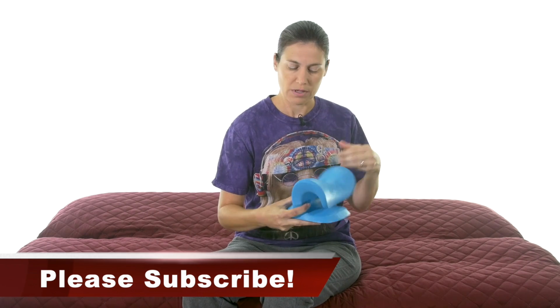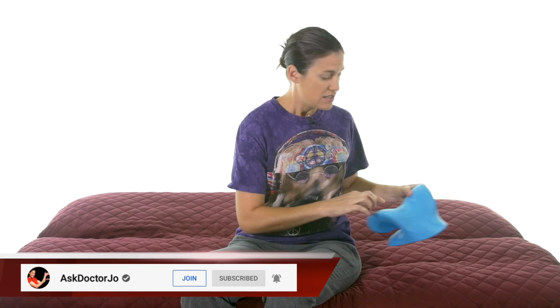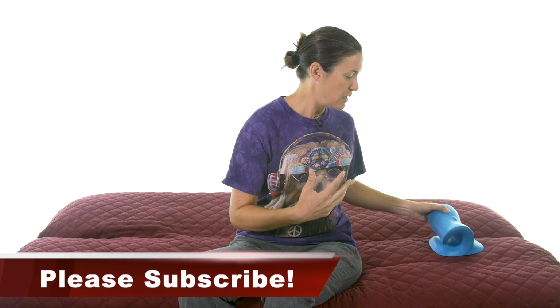So again, what's really cool about this is you can use it on a bed, a couch, or the floor. Sometimes a little firmer surface is better, but if you can't get down on the floor, you can do it on your bed if your bed's not super squishy. Having this part where your head is supported is the one that's a little bit less pressure. And then this way, it's going a little bit more into that extension to get that curve and open up the spaces. So I would always recommend, again, the lightest way first. And you can see these little knobs here that give you a little bit of extra pressure on some of those pressure points in the muscles in the back there, to help release those.